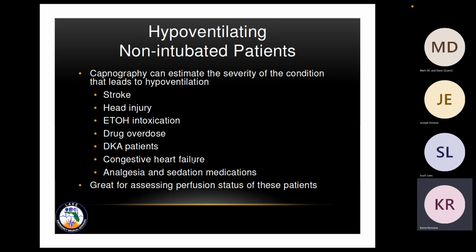Other hypoventilating non-intubated patients as well, capnography will estimate the severity of the condition that leads to hypoventilation, whether it be stroke, head injury, ETOH intoxication, drug overdose, DKA patients, congestive heart failure, or analgesia, or sedation medications, right?